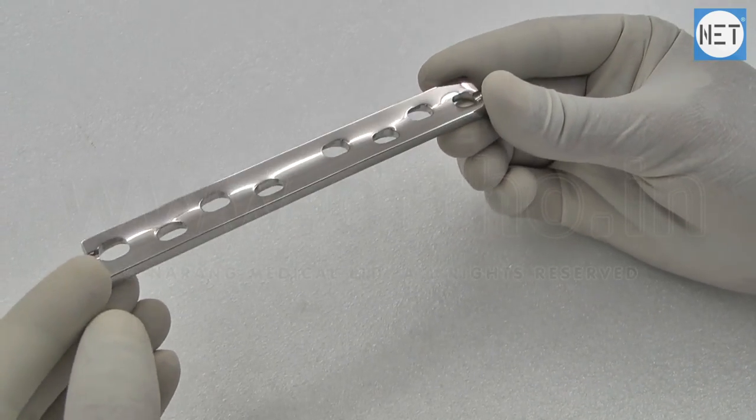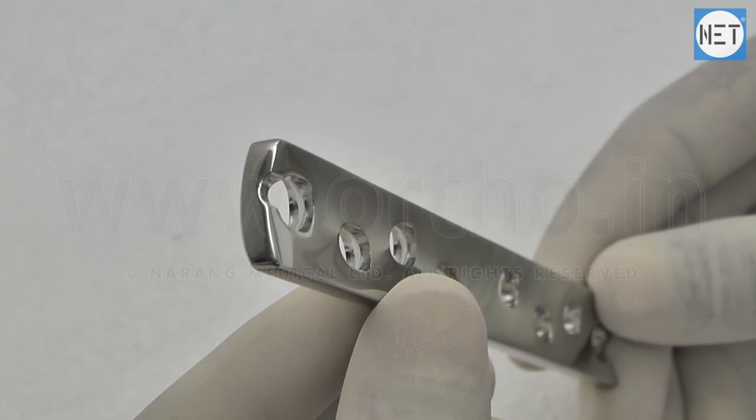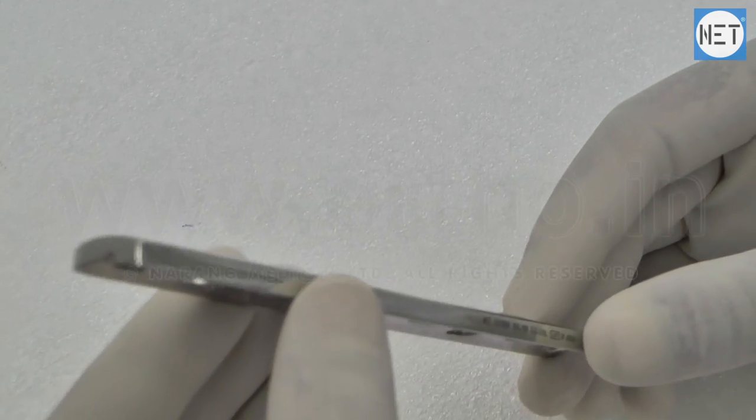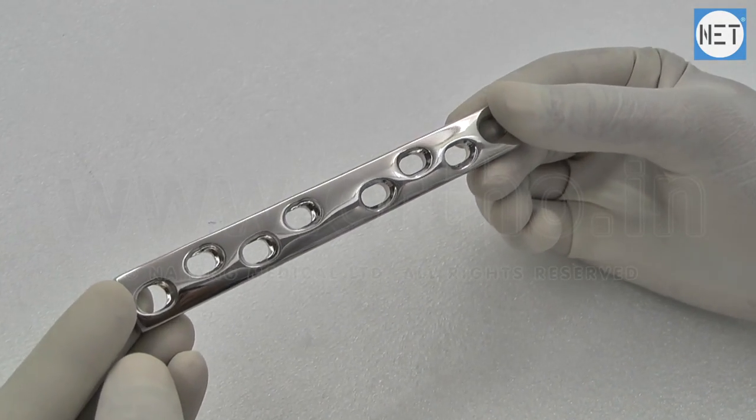These are also used in fixation of periprosthetic fractures, osteopenic bone, and fixation of non-unions and mal-unions in adult patients. The oval shaped hole is designed to create dynamic pressure between the fractured bone fragments.